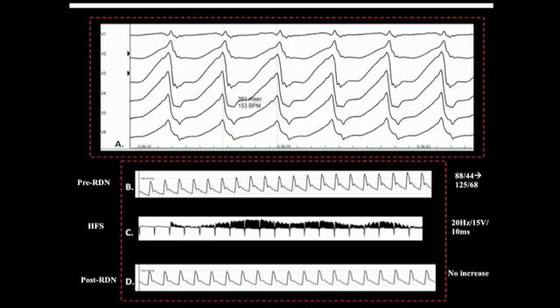In this case, with the combination of epicardial and endocardial mapping as well as renal denervation, we're now about 8 months out. We do not have a loop recorder in place, so obviously all monitoring with AFib is limited, but we do 2-week monitors at 3, 6, 9 and 12 months for all of our AFib patients, and to date this patient has been AFib free.